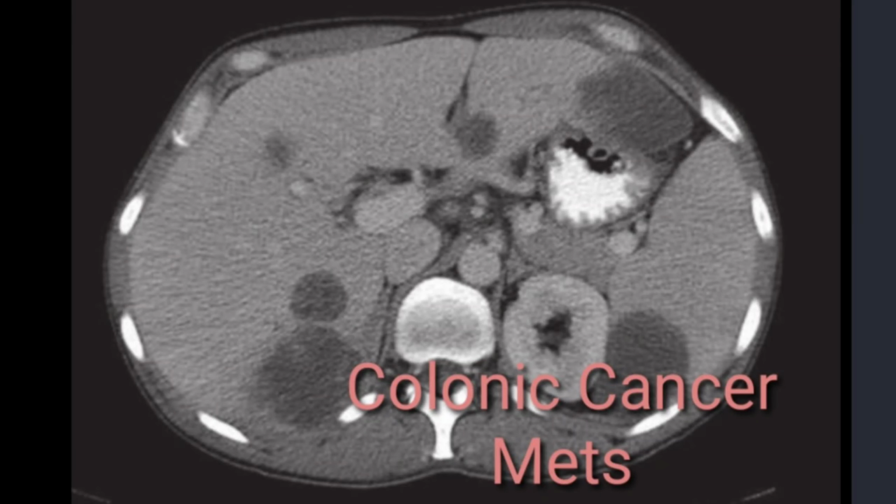As the previous slide was a bit confusing, showing characteristics of both benign and malignant lesions like hemangioma and also metastatic deposits, that's why a CT scan was advised. On the CT scan here you can see the liver is enlarged and there are multiple hypodense lesions within the liver parenchyma. Also the spleen is enlarged and the splenic lower lobe shows a hypodense lesion as well. On the basis of these CT images and further investigations and biopsies, it was confirmed that this case was colonic cancer. So this CT scan also shows metastatic deposits.